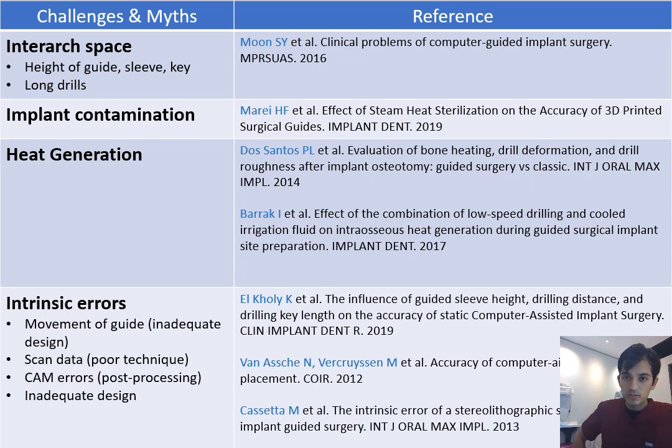Now, when we talk about digital dentistry and digital implantology, there's a lot of challenges and myths being thrown around out there. Does it work? Does it cause heat generation? Is there enough space to use these implant drills, which are typically longer than regular drills? So we're going to see if we can debunk some of these myths and show that digital really is not that difficult and can work in most cases.